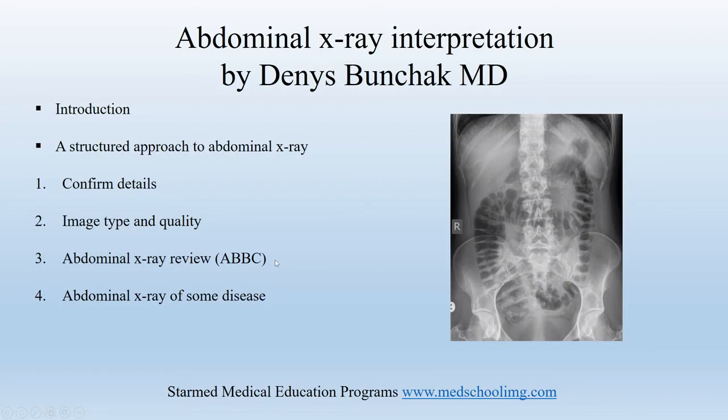There might be people who use different mnemonics, and in my opinion there is no such thing as wrong mnemonics, it's just about the structure. If you structure the approach to the X-ray, it's less possible that you will overlook something and you will hit all points and all details of the X-ray. So buckle up and let's begin.